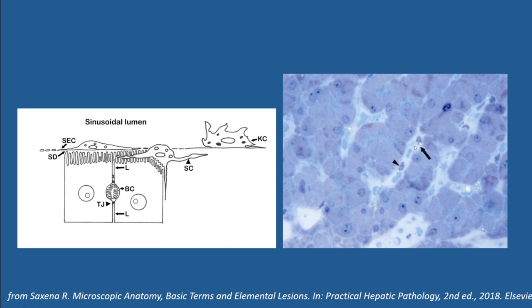These are the vitamin A storing cells. They are also the cells that give rise to fibrosis. And these are also sometimes called the Ito cells. And here we see the sinusoidal endothelial cell. So this 1 micron section highlights all these other things that we seem to know only conceptually.